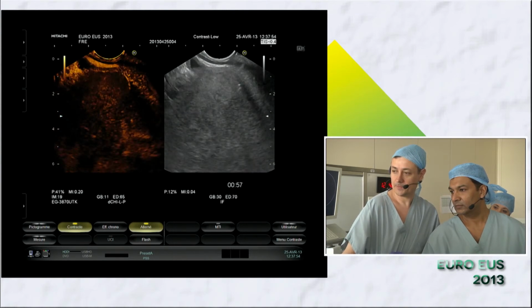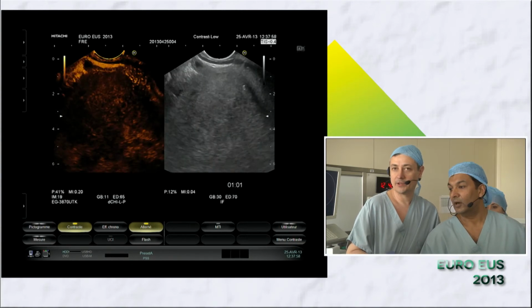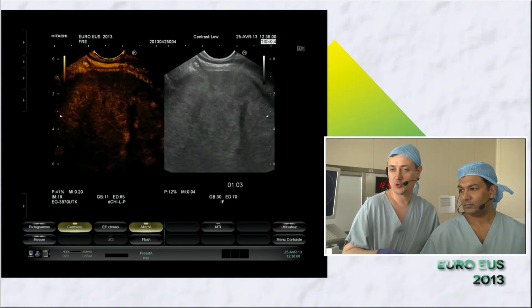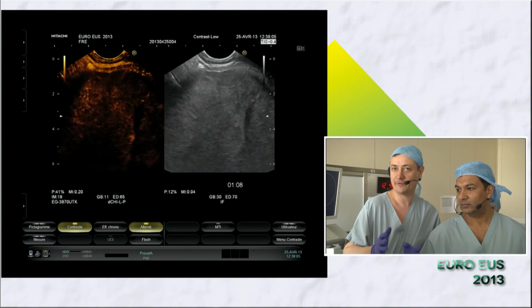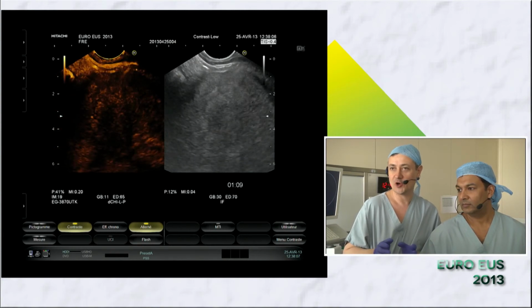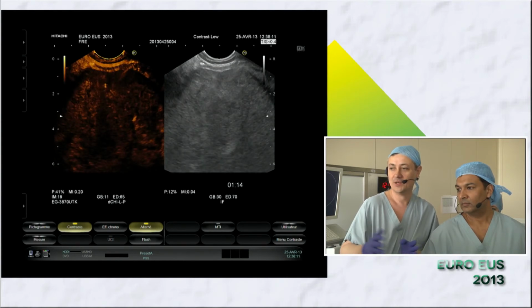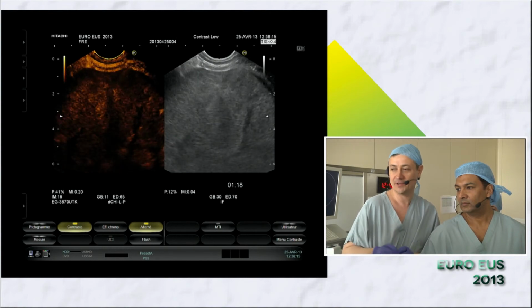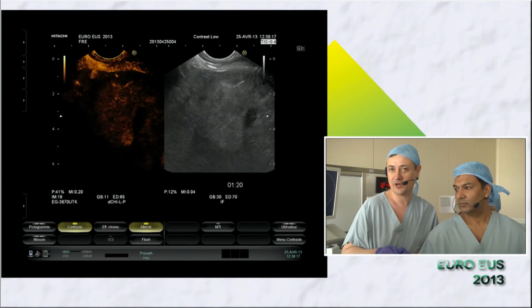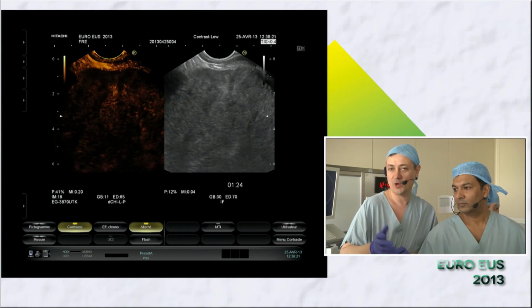The trouble is also, the larger the hemangioma, the more atypical its behavior can be. They usually enhance very slowly, so that's one of the limitations of Sonoview, because after 5-6 minutes you lose the contrast. With a CT, you can do a late phase examination, which is really longer. So that's one of the disadvantages of contrast ultrasound for the liver, the Sonoview.